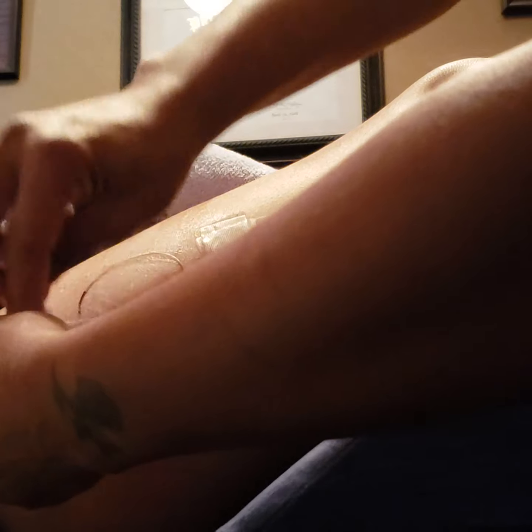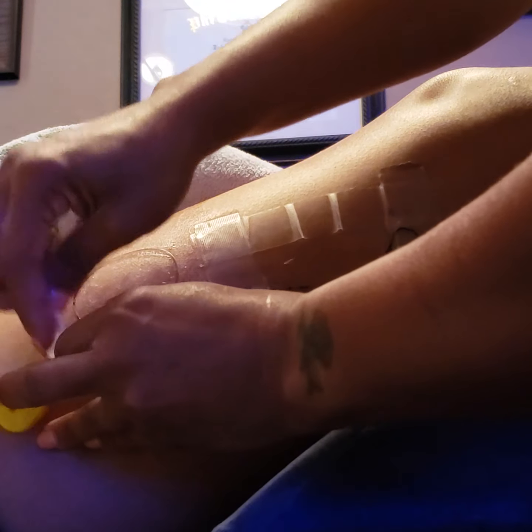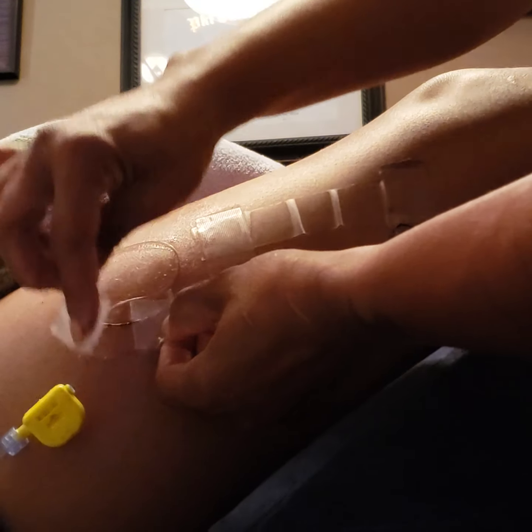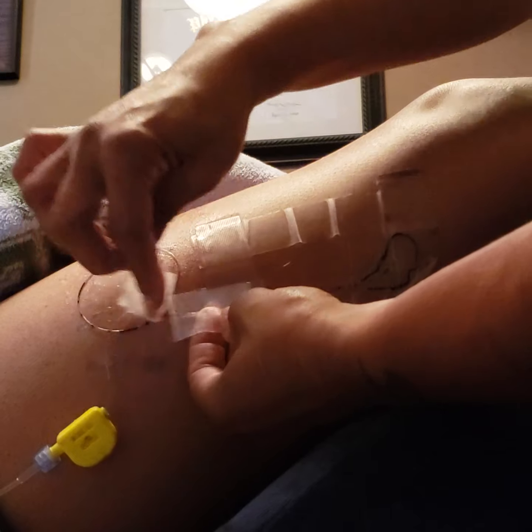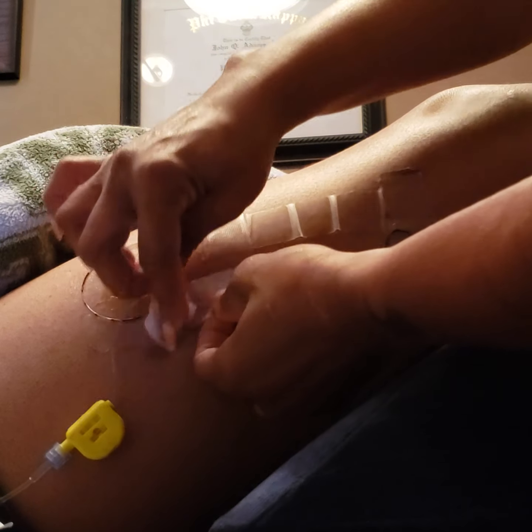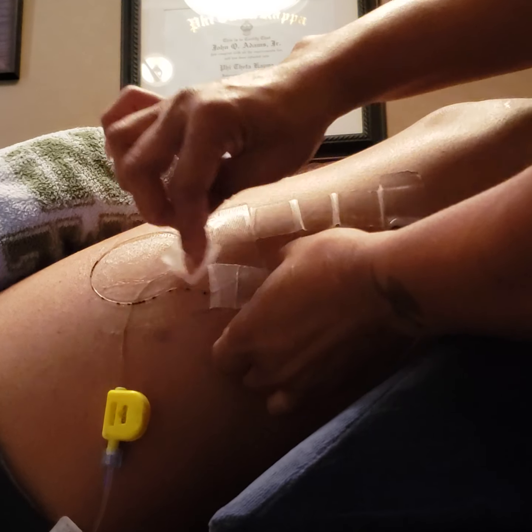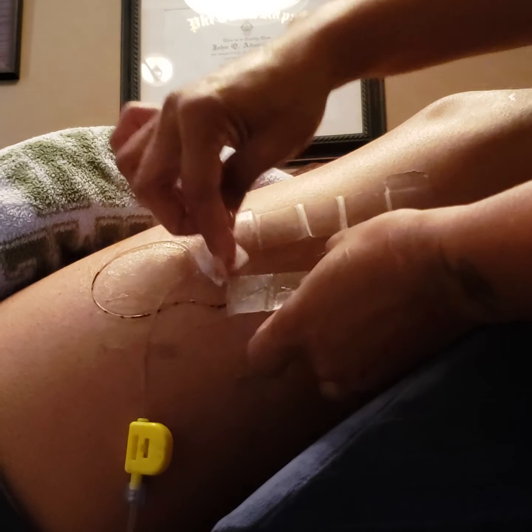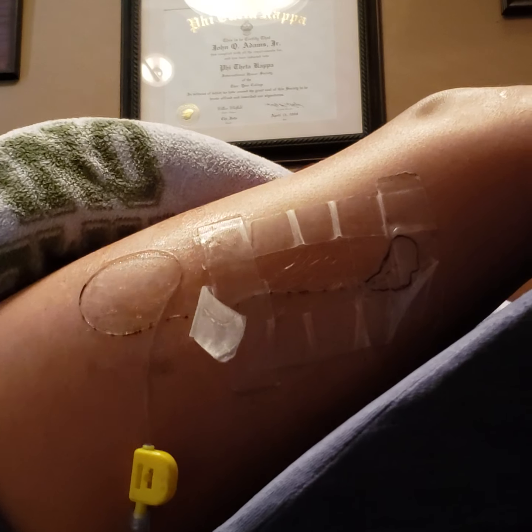I don't know how well this nerve block worked because he was also sent home on some other pain medication. I was wondering if I was supposed to squeeze the bottle, but no — it infuses continuously by itself.